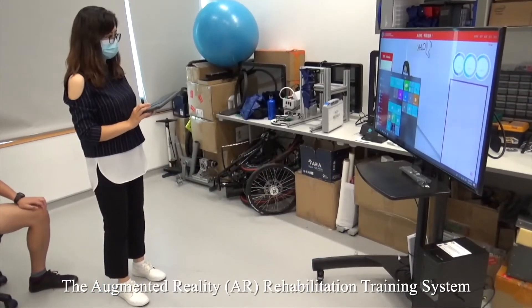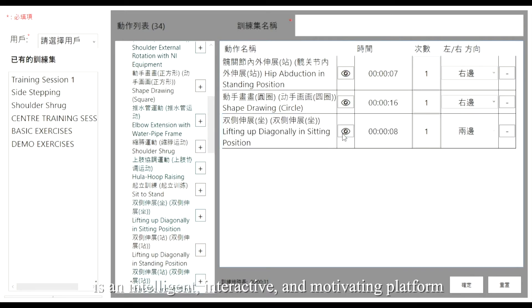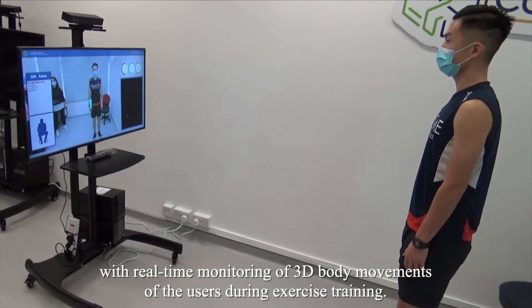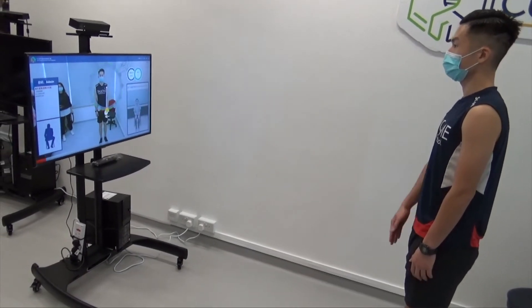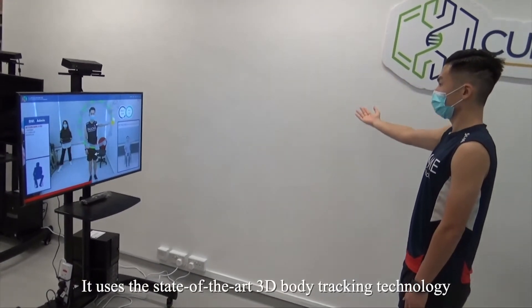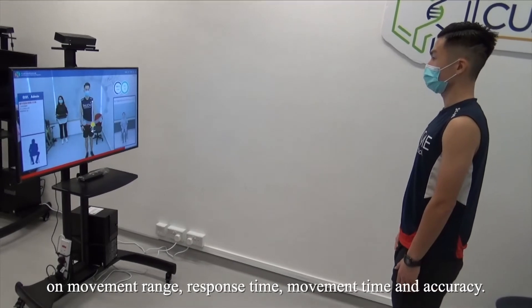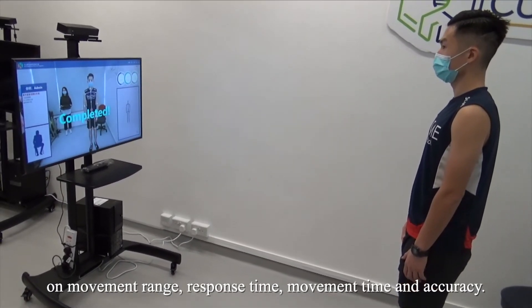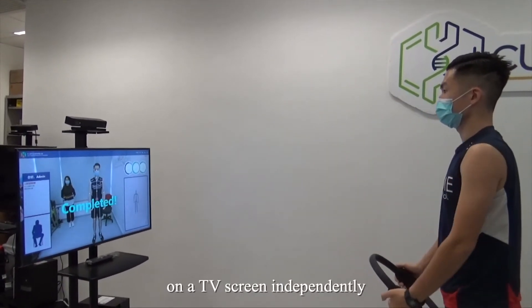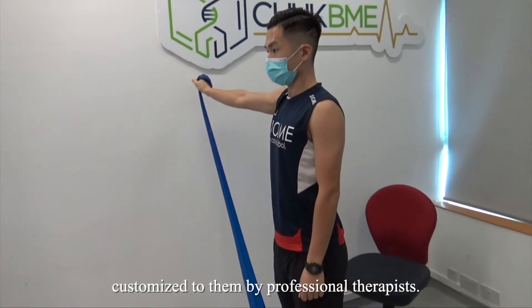The Augmented Reality AR Rehabilitation Training System is an intelligent, interactive and motivating platform with real-time monitoring of 3D body movements of the users during exercise training. It uses state-of-the-art 3D body tracking technology to provide objective, accurate and comprehensive data on movement range, response time, movement time and accuracy. Users can follow the exercise program on the therapy screen independently, with their training schedules and routines customized to them by professional therapists.